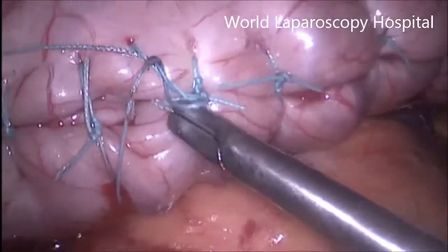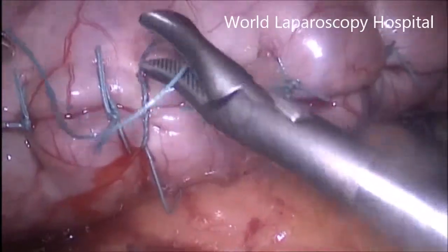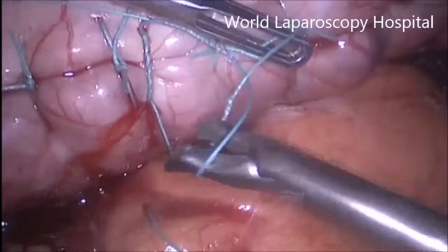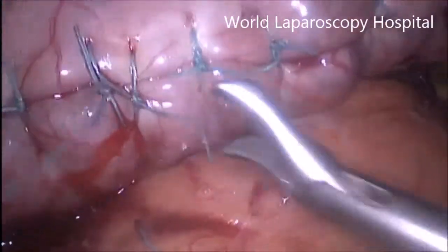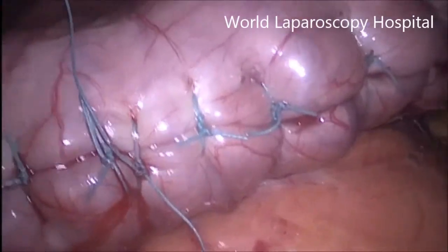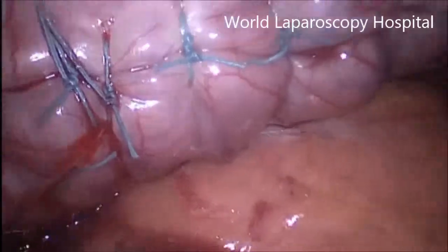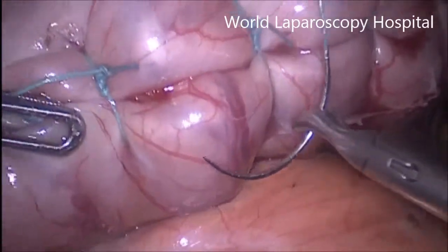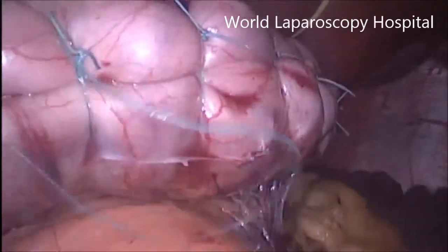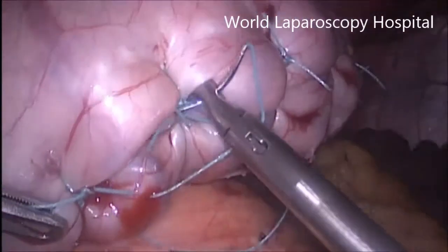Again the same way, only suturing, suturing and suturing. That is the main art of gastric plication, is suturing. Otherwise it will not give you the same effect. And your suturing should be standardized. Every time it should not give a different type of result. If you want, you have to standardize the procedure. And it should be properly plicated.